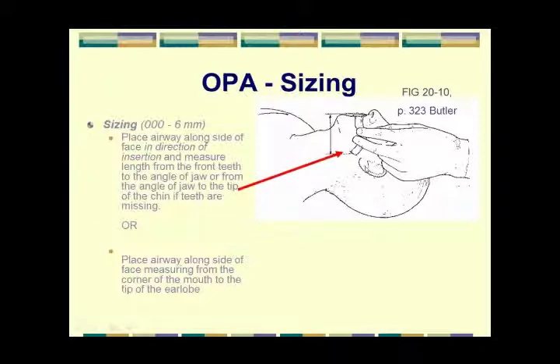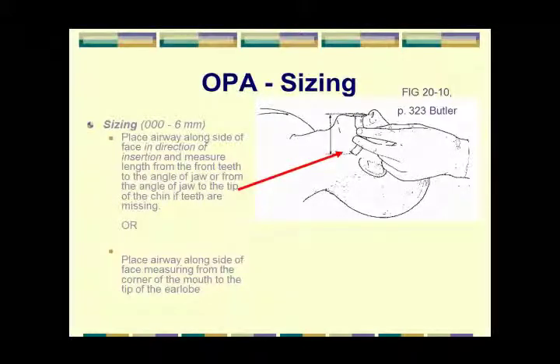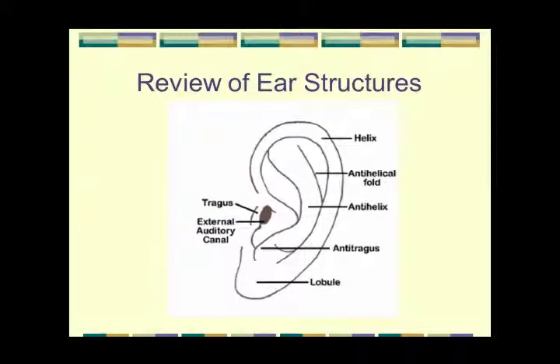Physically pick up the airway, measure it, and if it's not the right size, choose another one. Okay? Because there's sizes all the way from a neonate through an adult. And usually the little bag of goodies you have has 4 or 5 different sizes in it.